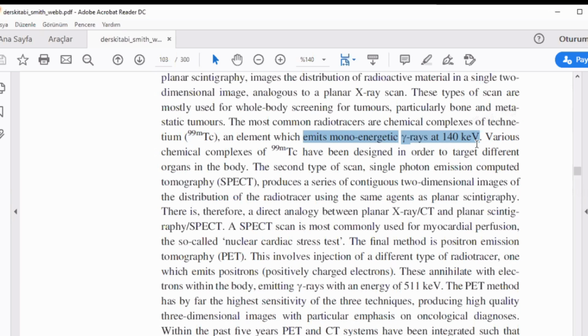This is one of the lowest ones, okay? You remember X-ray imaging techniques are from 20 keV to say 150 keV, but not in the clinical environment. So this is the lowest energy range of nuclear medicine, which is the highest for conventional X-rays.